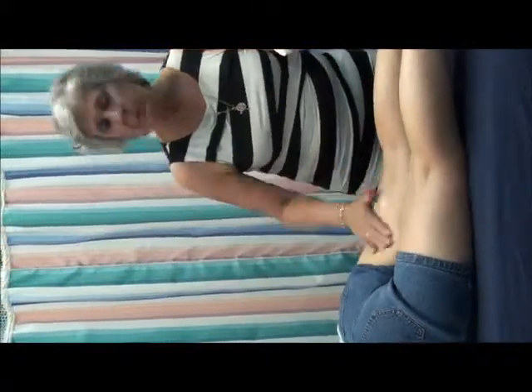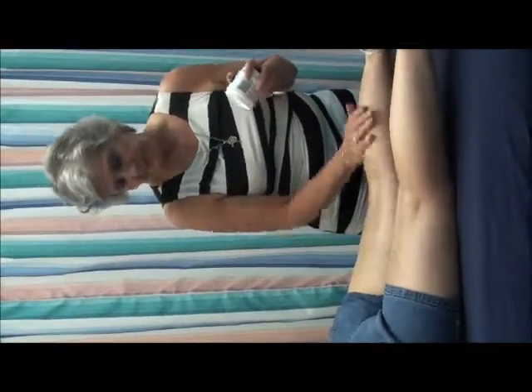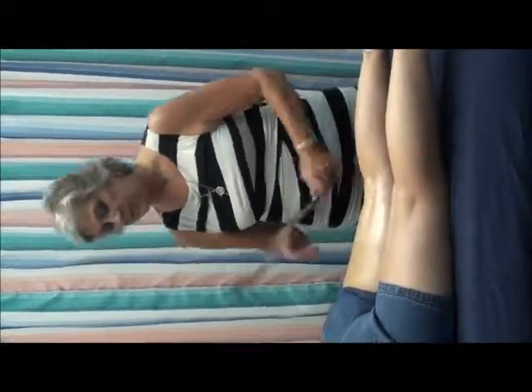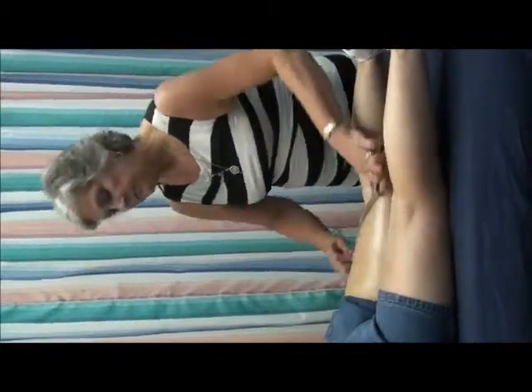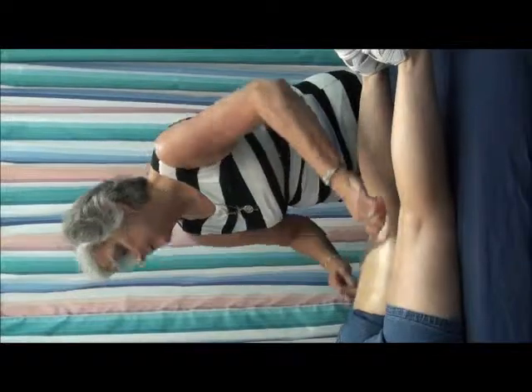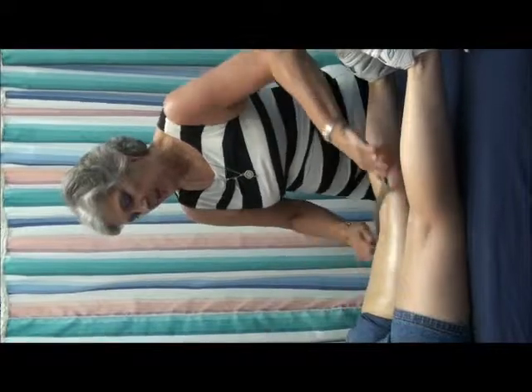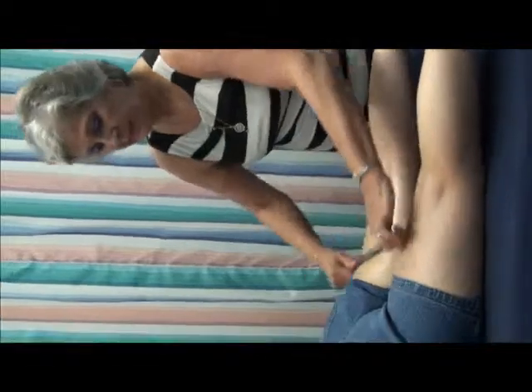What I do first is I put an emollient on the muscle, and this is to allow the instruments to slide. The first thing I use is my instrument that diagnoses, and I will slide this both up and down on the muscle. And I can feel some grit right here. Do you feel that? Mm-hmm. Yeah. And it actually is bringing up red right away, which is indicative of there being adhesions in there.